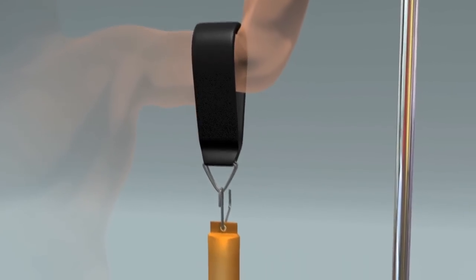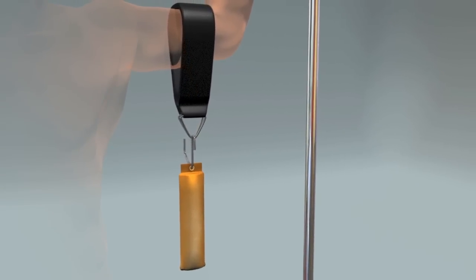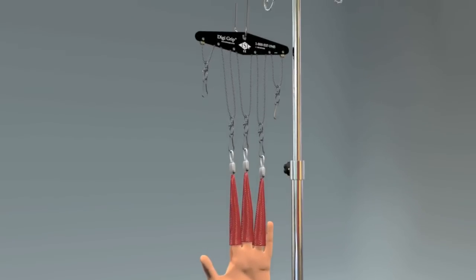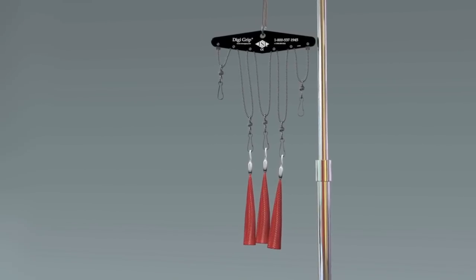The ISI DigiGrip system includes a traction strap for counter traction and hooks for attaching weights. Both finger traps and weights are sold separately. Finger traps are available in both metal or nylon and a variety of sizes.